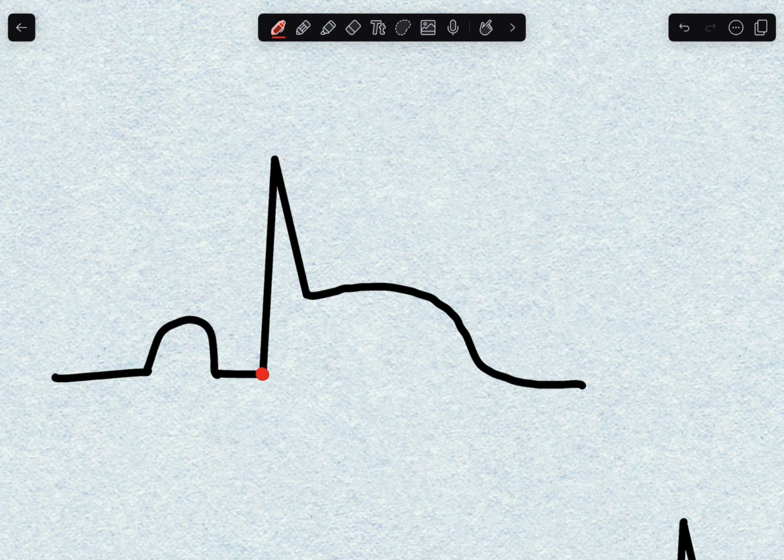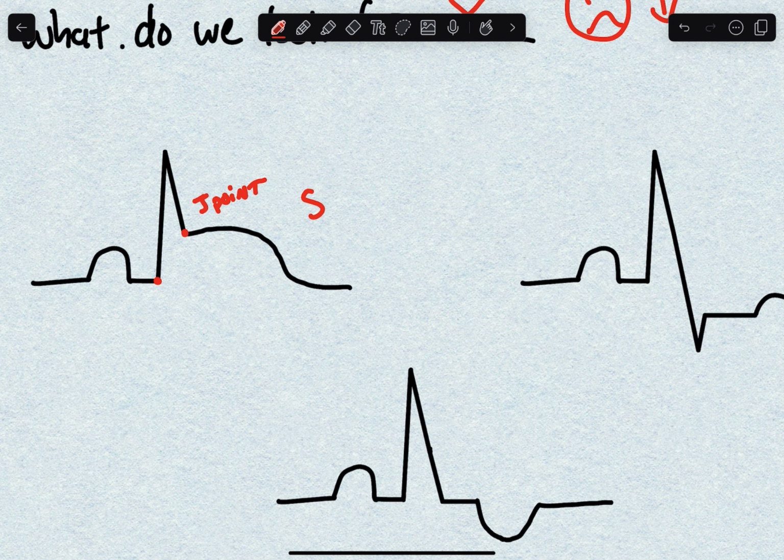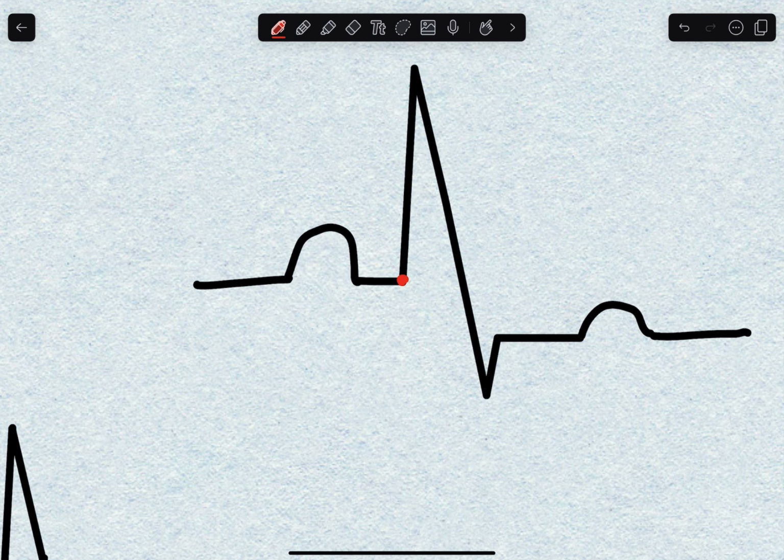Now I'll get into the specifics of the cardiac cycle in the next lecture, but for now, I want you to understand that there are general signs of damage to the myocardium. Sometimes these signs can show elevation of the ST segment, other times it can show depression, or inversion of the T wave. The ST elevation is a sign that the heart is damaged and is changing its physiologic and metabolic environment that can be seen and measured.